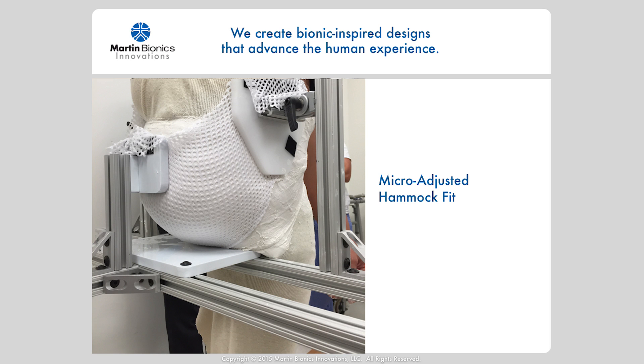This casting technique allows for micro-adjustments of the fit simply by pulling the special mesh fabric tighter or looser to distribute the forces evenly across the entire seating area. The fitting process is completed in the cast itself, and the cast shape becomes the final socket shape, significantly reducing the time and expense of the fitting process.